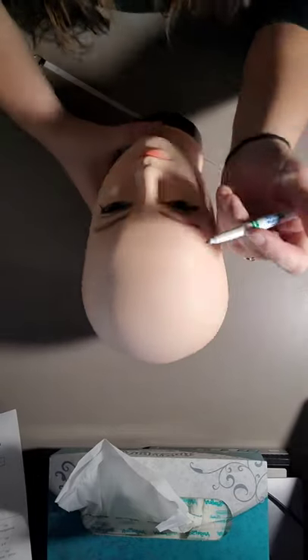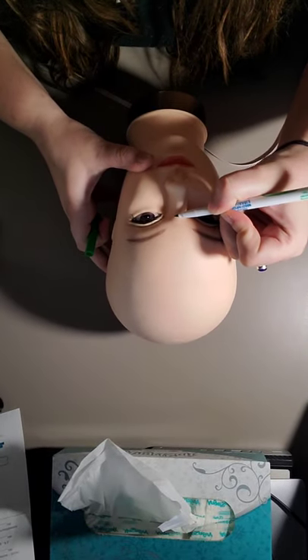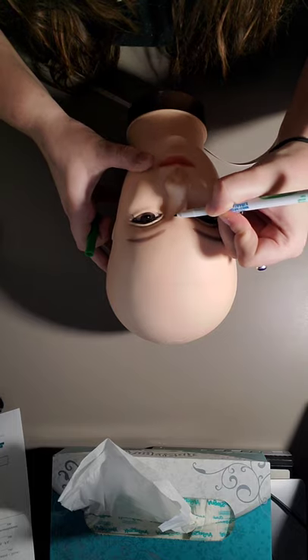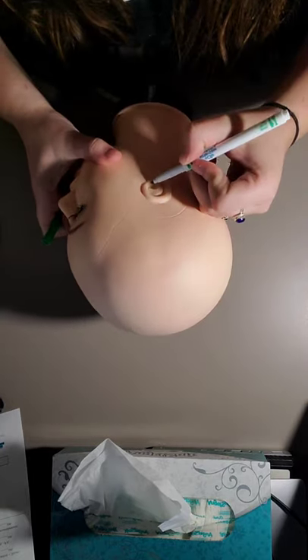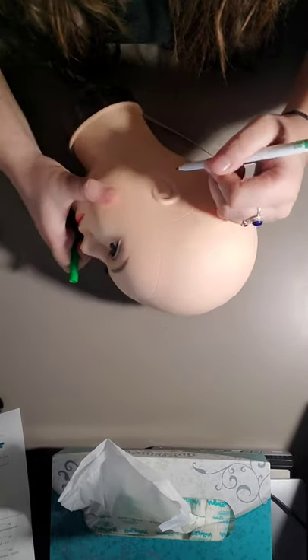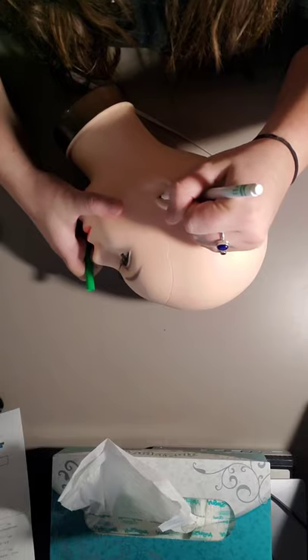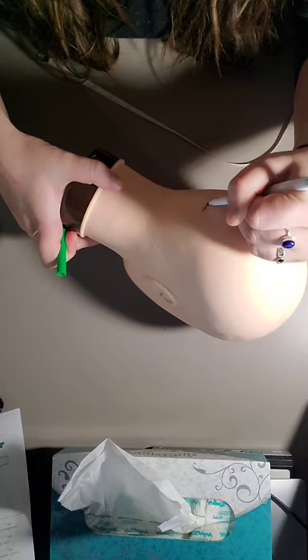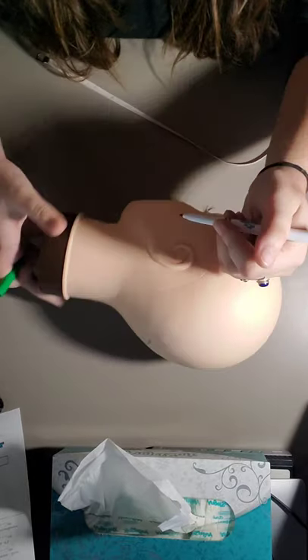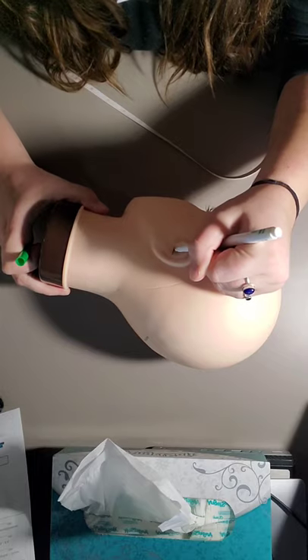First things first, I'm going to put some landmarks on my beautiful bald model. There's the nasion. We'll do a preauricular point here and then we'll do our inion here. Keep that in line with that. The next preauricular point is here.